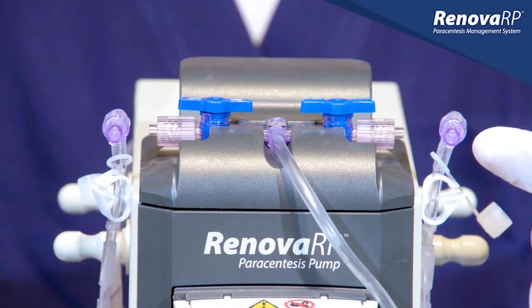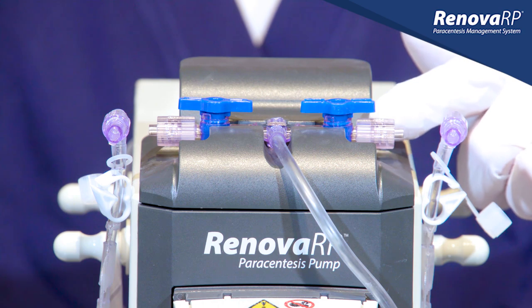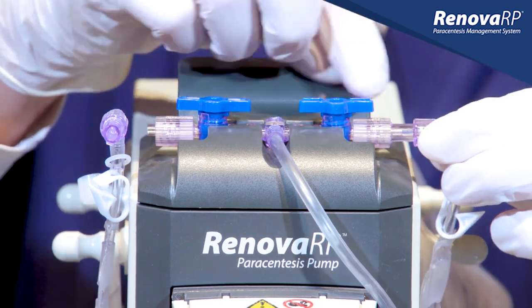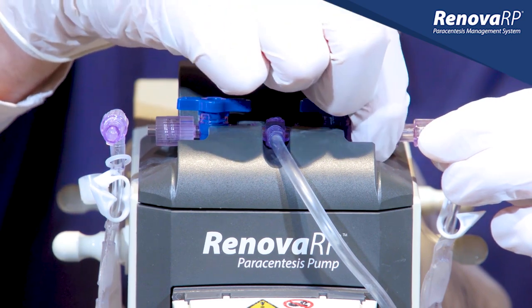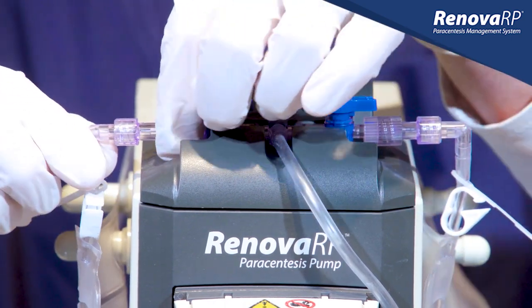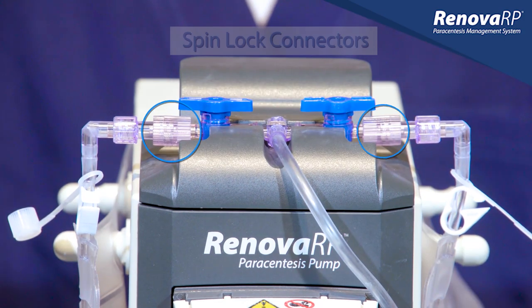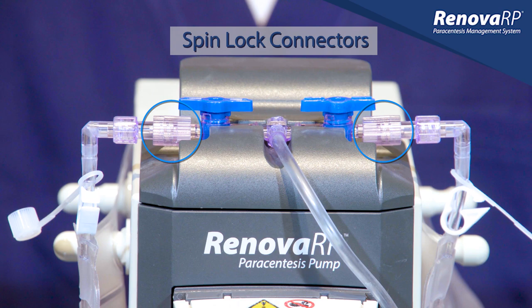The bag to tubing connection is very important, so take care to ensure you have firmly connected the bag to the T-connector and that you have tightened the spinlock connector. One spinlock connector is tightened clockwise while the other is tightened counterclockwise. Failure to properly tighten the spinlock connector can result in the bag disconnecting during the procedure, increasing the risk of fluid exposure.